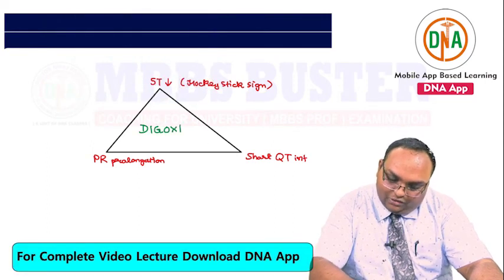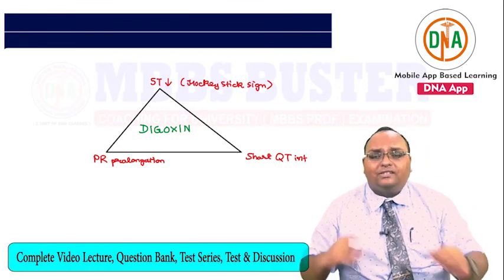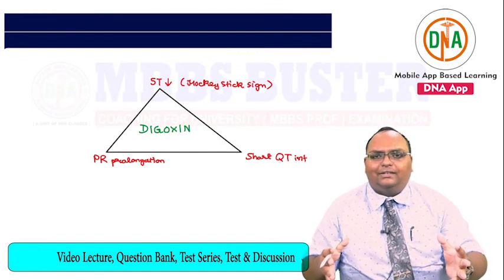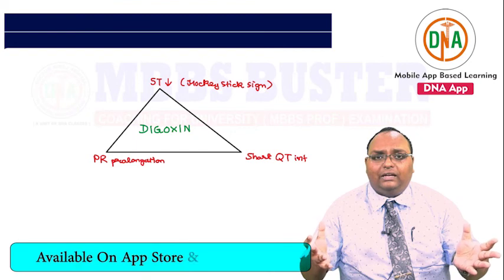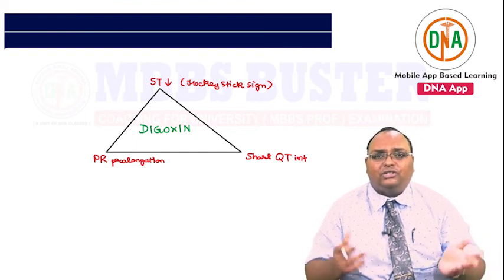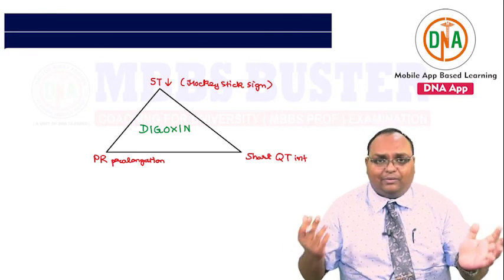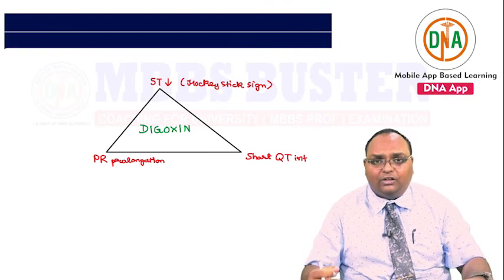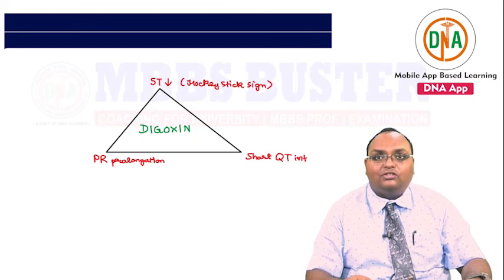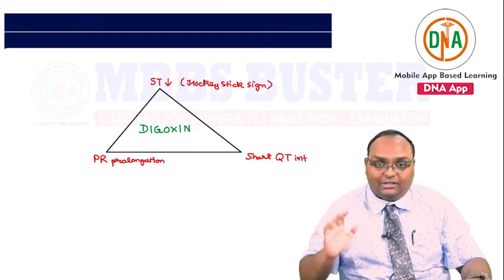There are very many other causes of ST segment depression, as I already told you. Wherever there is a mismatch between the supply and demand of blood in the heart, apart from the fact that it can also happen in situations where the person is being made to do a treadmill test or is undergoing some physical exertion. So in all these cases you might have an ST segment depression along with concurrent hypertrophy of the musculature of the left ventricle. But over here we are concerned about which drug causes this ST depression, which looks like a hockey stick. So yes, it is digoxin.